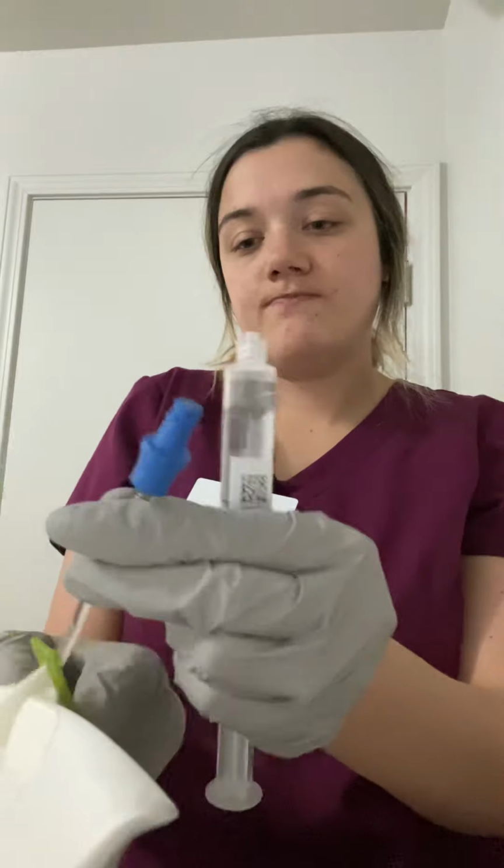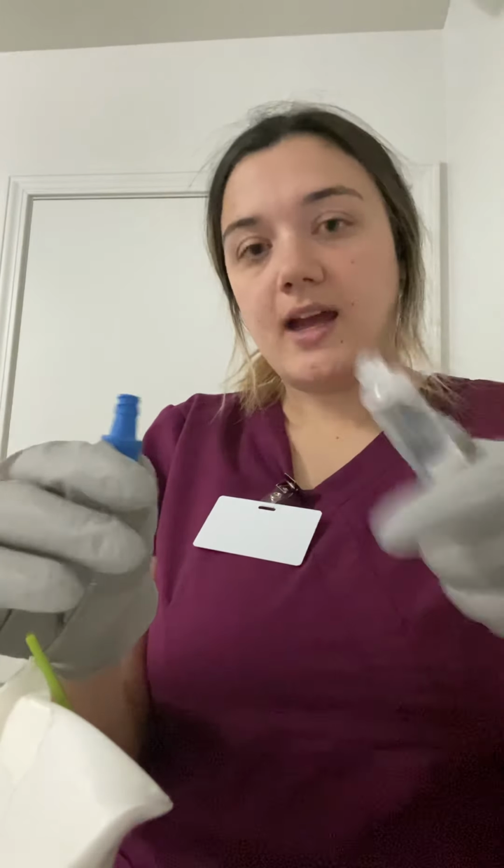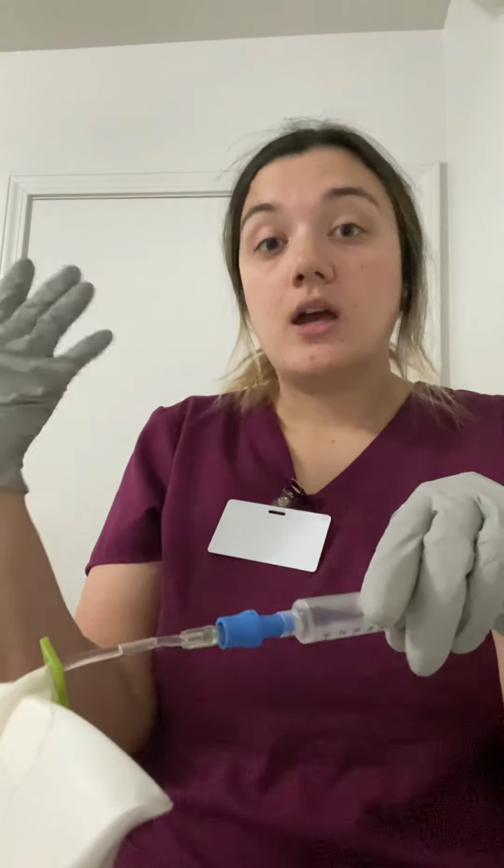And then now we're going to scrub the hub again for 15 to 20 seconds. Now we're going to flush the rest of our syringe. You want to flush the 4 mils of normal saline, since that's what you pushed of the medication.